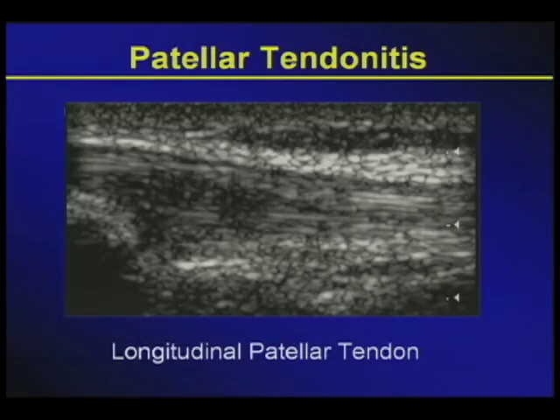So patellar tendinosis, after you've identified it, take a closer look at what's happening, because well within the substance of the patellar tendon, you begin to note that there are lakes or vacuoles being created, representing now true intrasubstance partial thickness tears or mucoid degeneration. The other thing you'll notice is that because of its proximity to bone, and bone is an active organ and it likes to react to violent insults, note that what used to be a crisp bone acoustic landmark of the apex of the patella in this patient with chronic jumper's knee now shows some cortical irregularity.